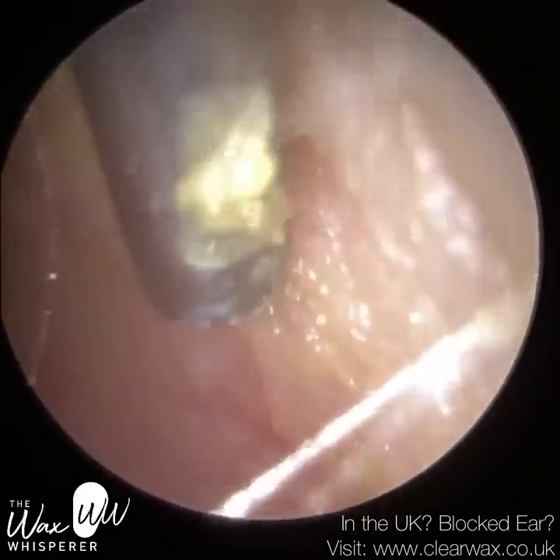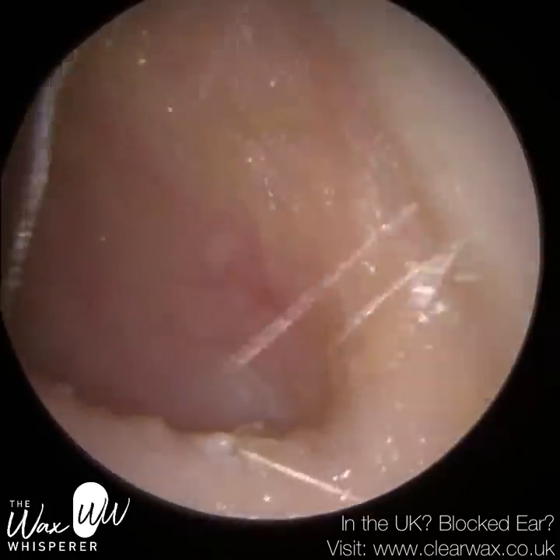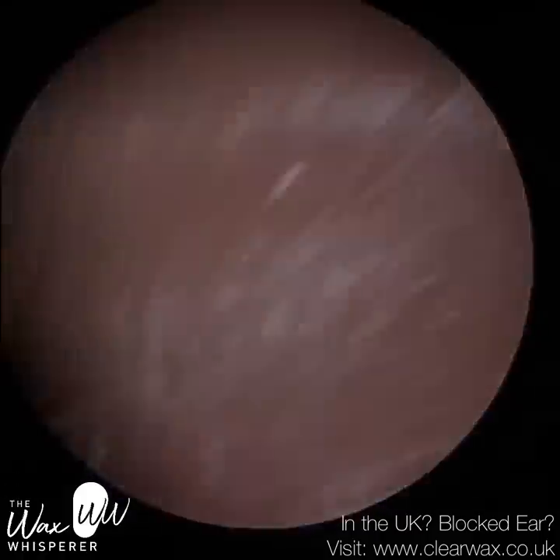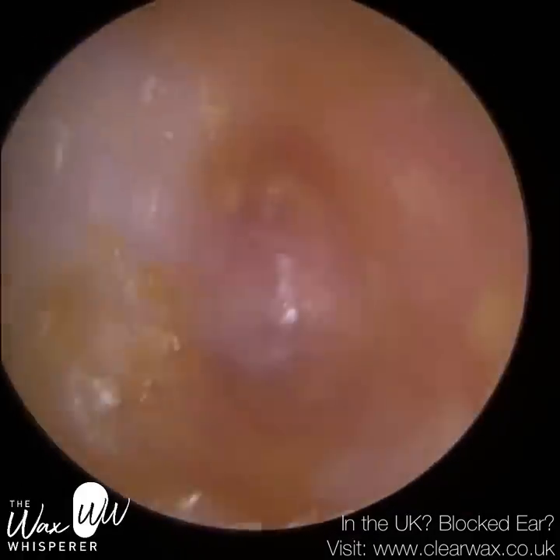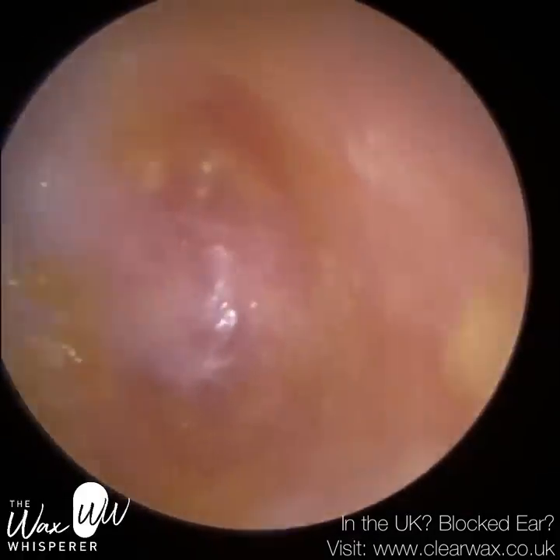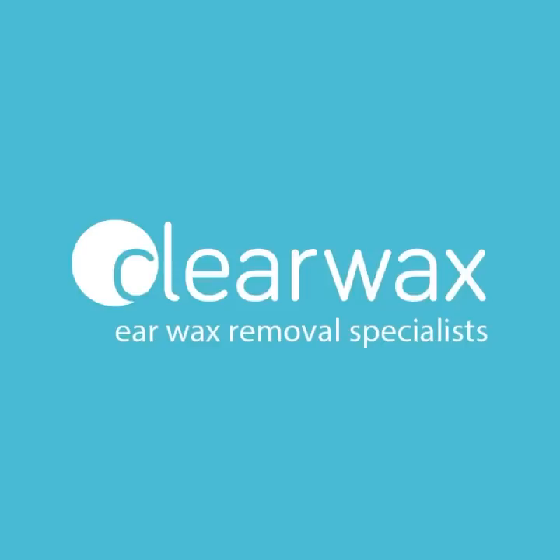So again, I'm just mopping up near the entrance, and otherwise I'm really happy with this case. Patient was able to hear significantly better with their hearing aid that they have. They don't want to have any further surgery because they're just worried about the healing process not going well, and this fibrous tissue getting worse.